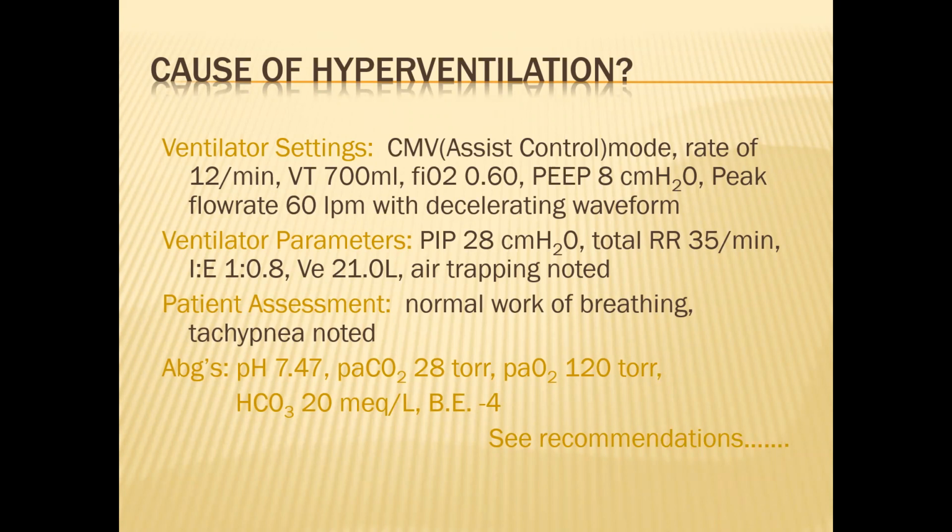For the pressure support breaths, yes, but there's no pressure support in AC. But yes, you're correct. Okay, what are the recommendations, Ms. Bean?